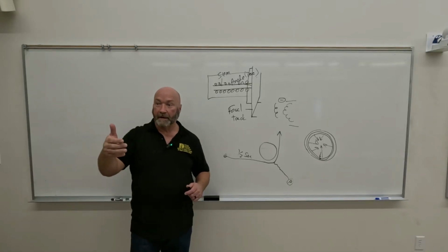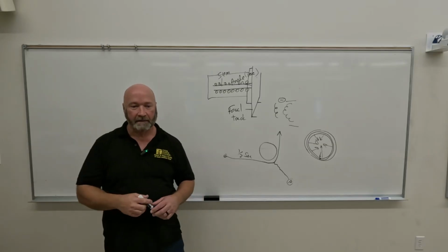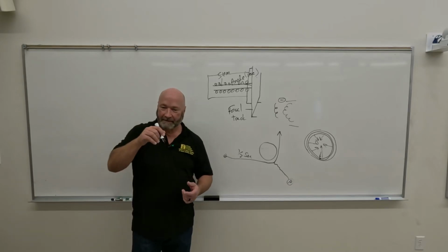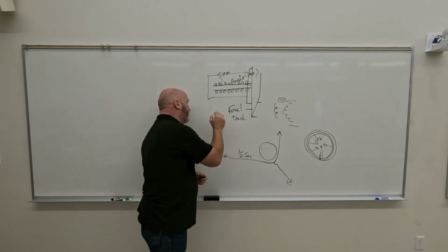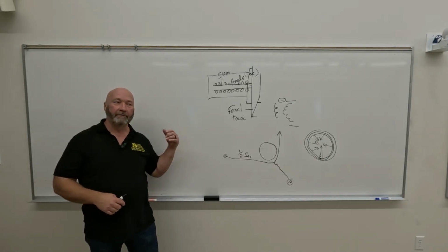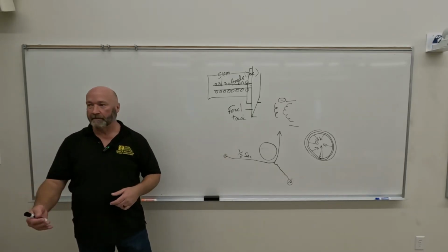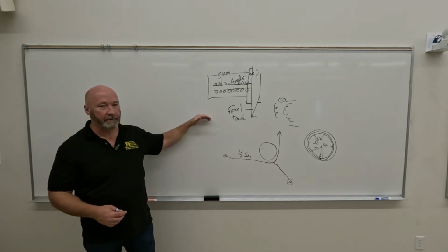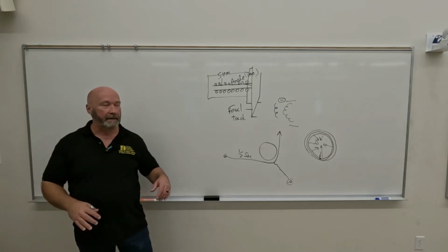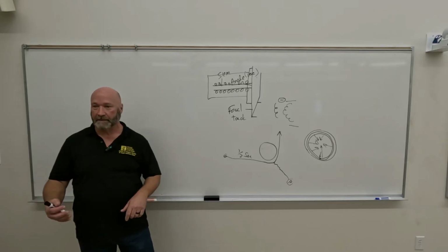on breast, because when I say micro calcifications, take your pen and just put a dot on your paper. I don't mean a scribble dot, I mean that's the size that we're looking for, okay? So if we use high KVP, then we can burn that out pretty easily, right? Even with digital imaging, digital processing, it can make it difficult to see. So we need very high resolution, and we need low KVP in order to visualize that with good processing algorithms to bring out the contrast so we can see those.